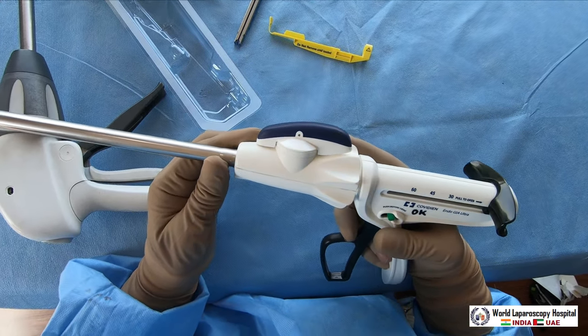Basically these are different types of staplers but the basic mechanism is the same. It works just like a paper stapler - when you apply it, the staple goes through and forms the shape of a B. In the same way, the laparoscopic stapler forms a B-shape and mechanically staples the two edges together. Thank you very much for watching this video - have a nice day.